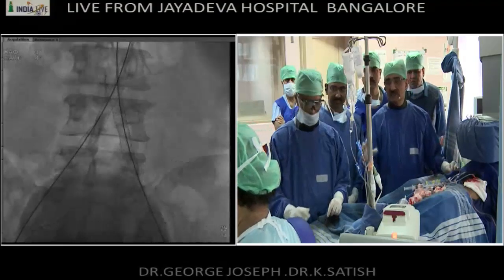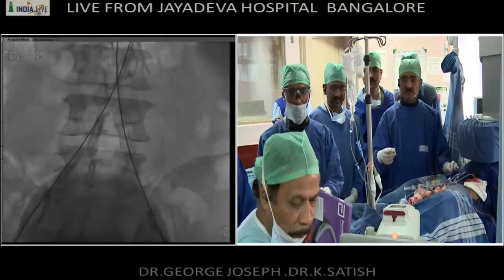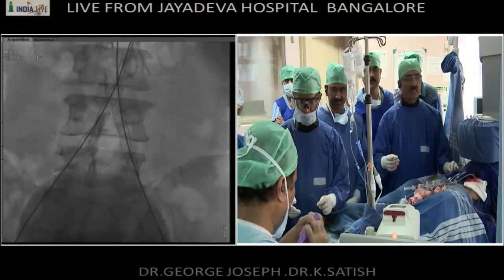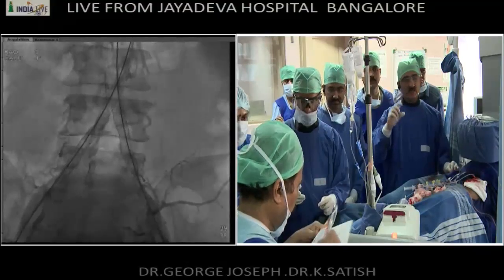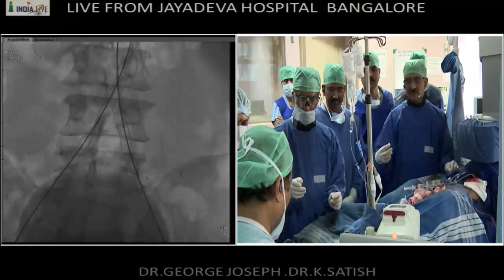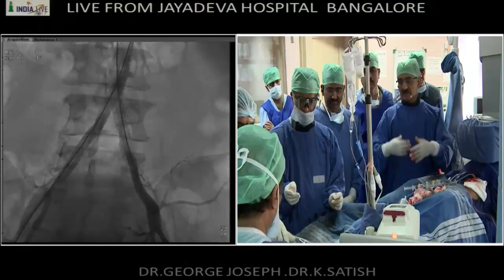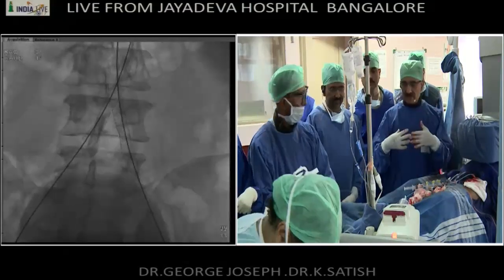Okay, so I'm going to make a compromise here. I'm going to take a balloon expandable 7 by 59 and then I will balloon the overlap zone with an 8 mm balloon so that they are not one smaller than the other.